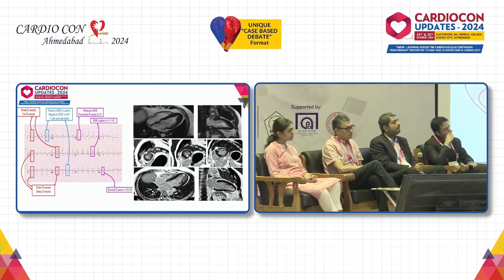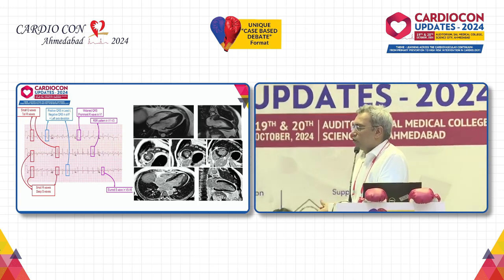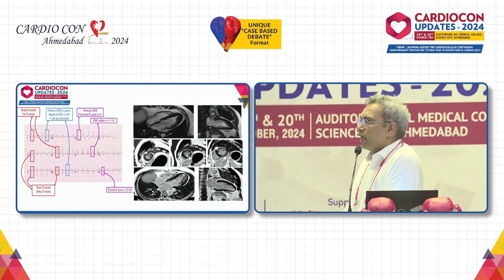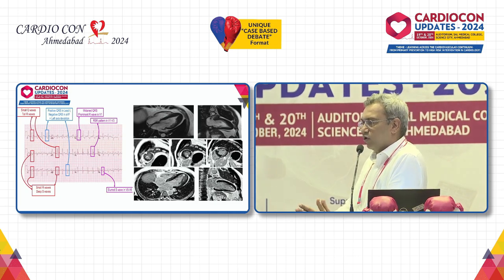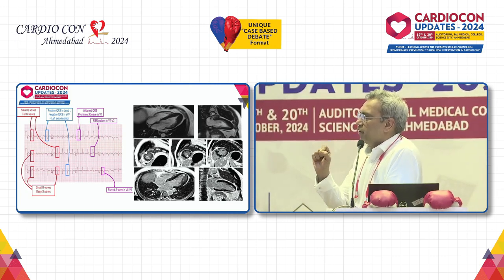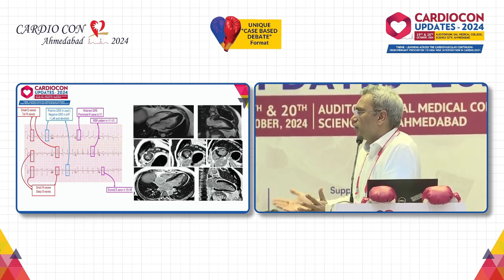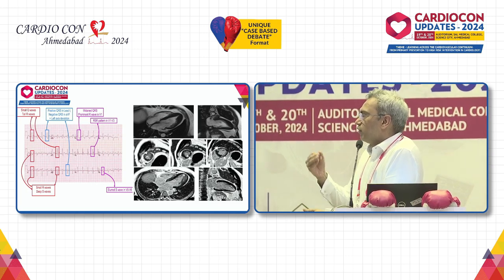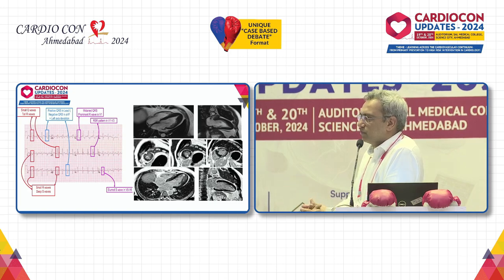So, a very valid and good question. Remember, when we are pacing, the conduction is not dependent on the location, it is dependent on the site of conduction block. So if your conduction pacing resolves that conduction block, it means that your job is done. And that is going to be determined by the QRS complex that is created by conduction system pacing.